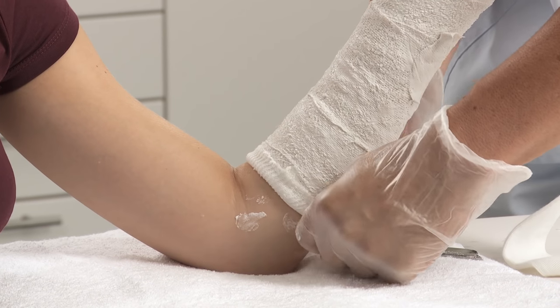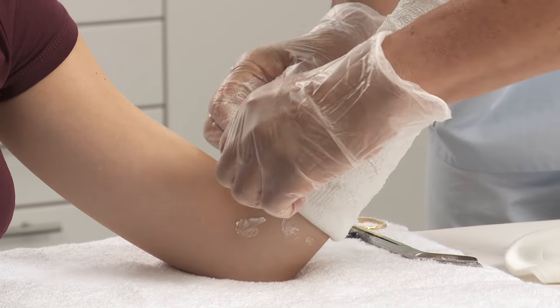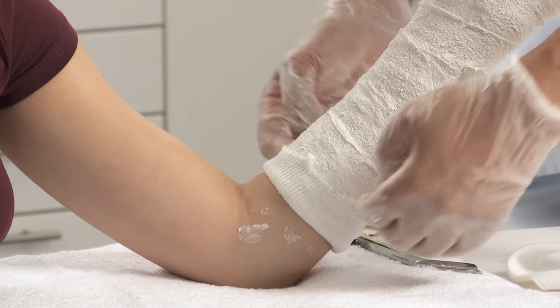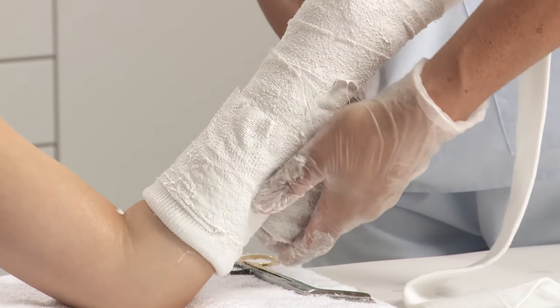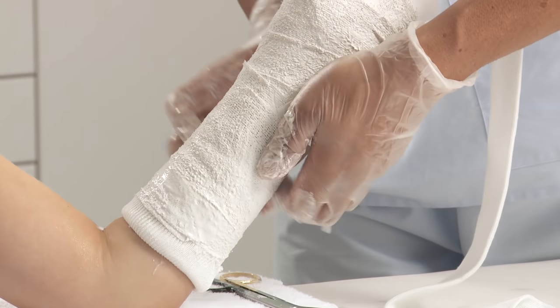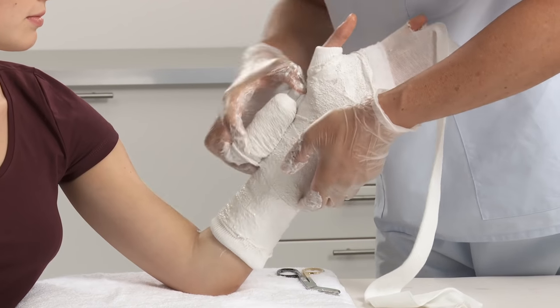Fold back the stockinette at the proximal end creating a protective cuff and soft edges. Take one more bandage of plaster of Paris and apply in the same way as previously, slowly, but starting from the proximal end.